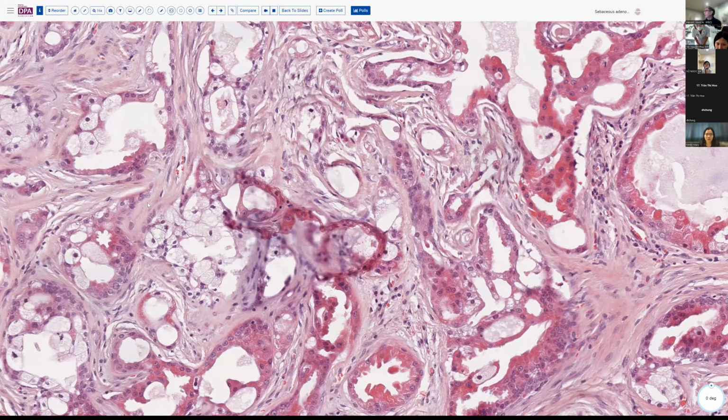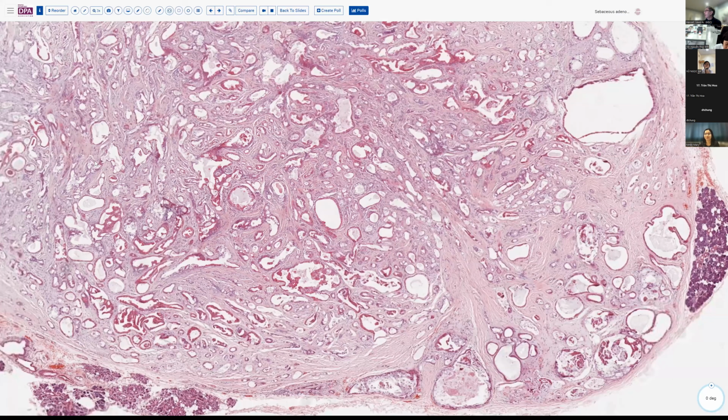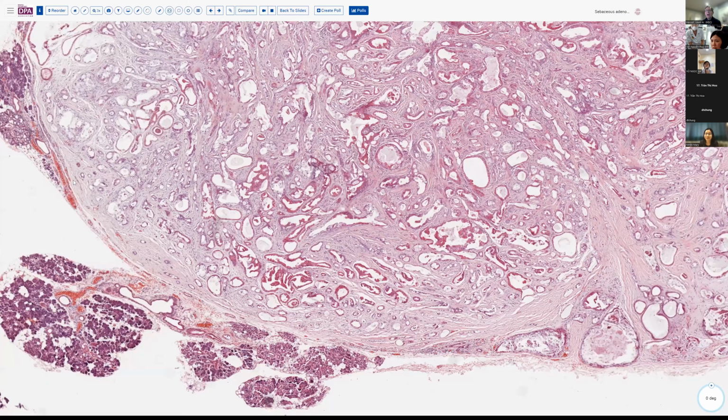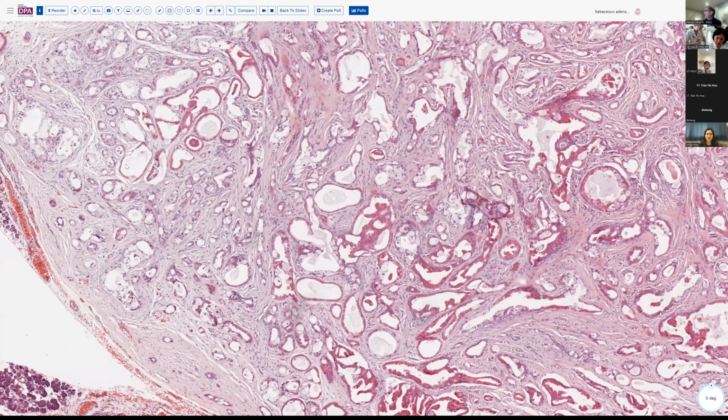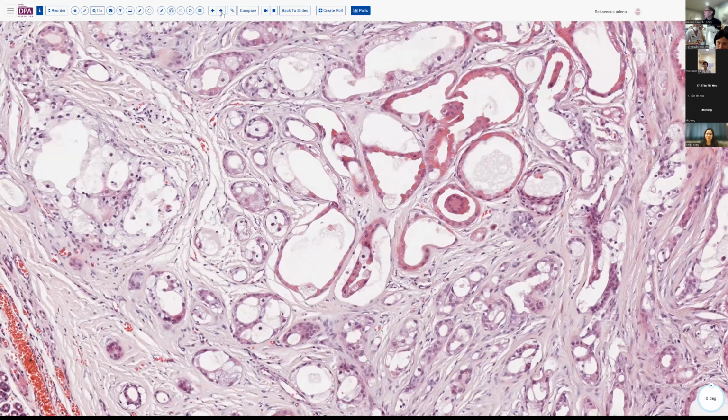As you noted from the low magnification, this looks a lot like a pleomorphic adenoma. It's got stroma and it's got epithelial cells. It's got a pretty sharp border here. So this is really just a variation on a pleomorphic adenoma, but with areas of sebaceous differentiation as we've highlighted here. Now, sometimes these lesions can become partly cystic.